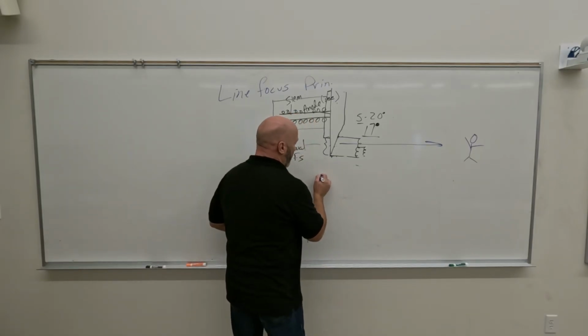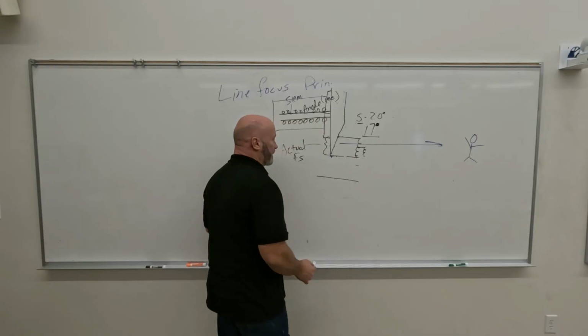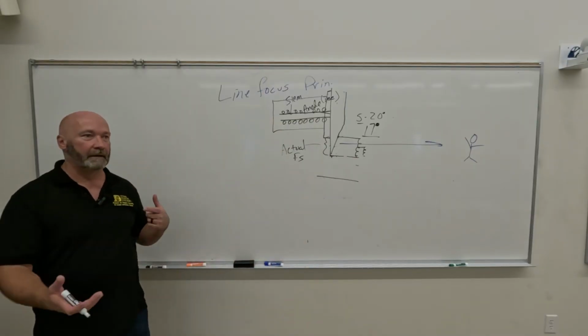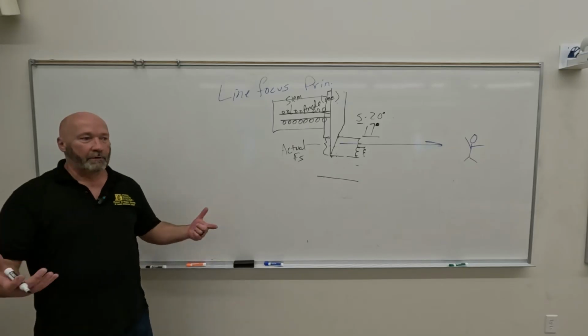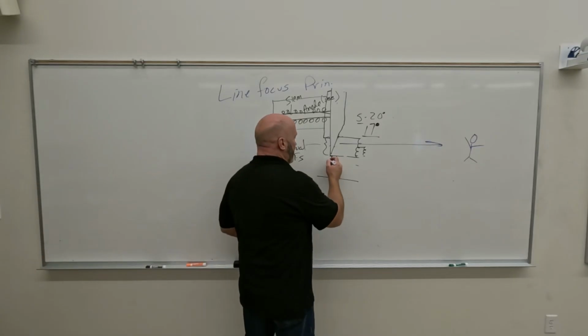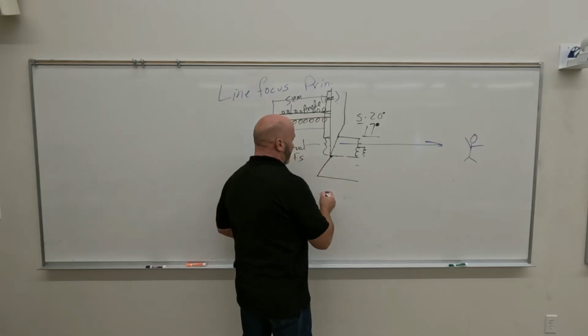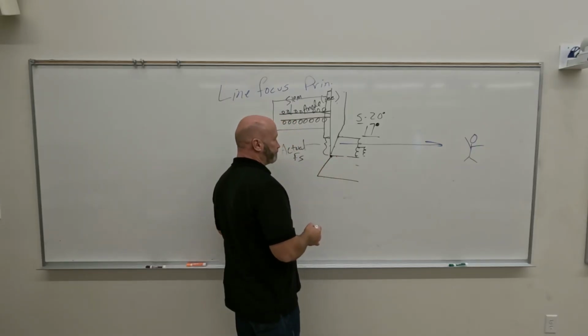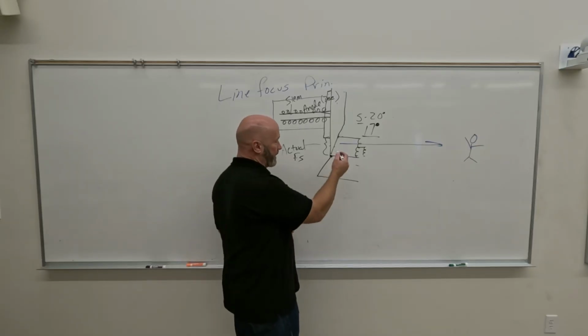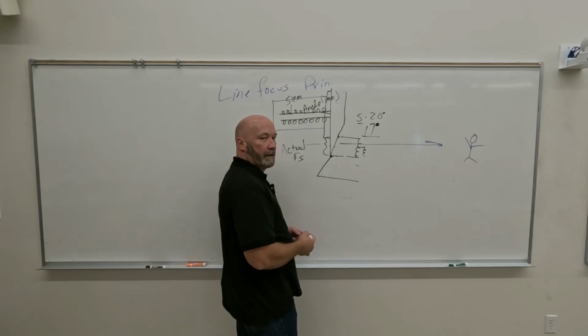So let's say our window is here. The window is what's supposed to limit the isotropic emissions to the useful beam, right? So if I create an X-ray photon right there, can it go out that portion of the window? Can it bounce right off the bottom, the heel of the anode?